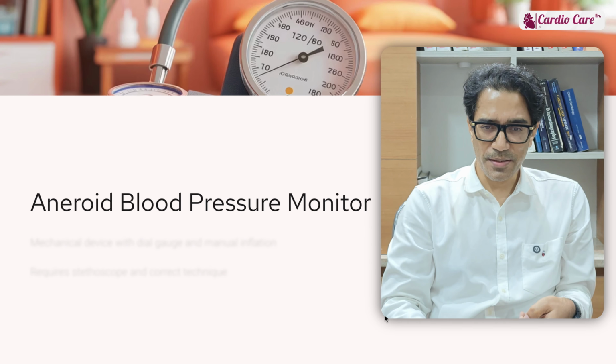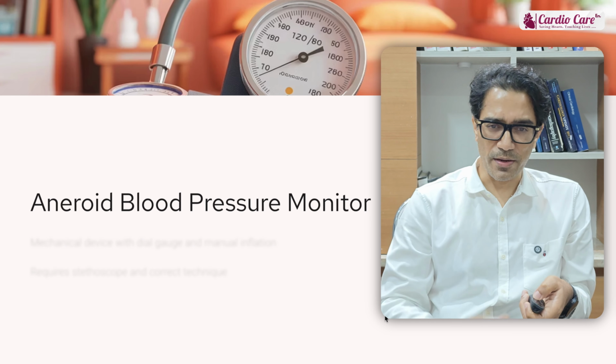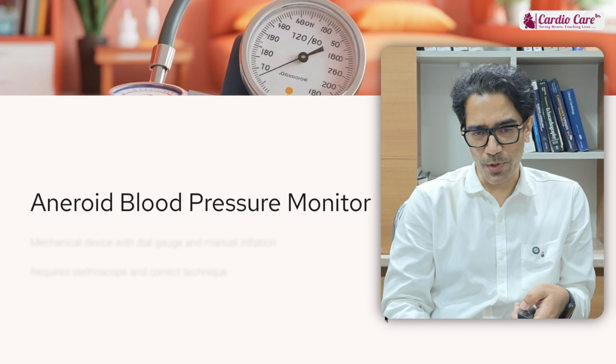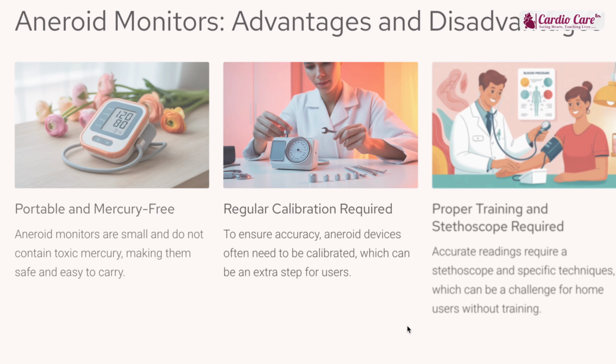So what is the second blood pressure monitor which could be used? These are aneroid blood pressure monitors. These aneroid monitors do not use mercury, so they do not have the same drawback as the mercury sphygmomanometer. It uses a dial and a pin method. The advantage is that it doesn't contain mercury. Another advantage is that it is not a bulky device, unlike the mercury sphygmomanometer. But the disadvantage is that it requires calibration, and needs to be calibrated frequently against the mercury based devices.